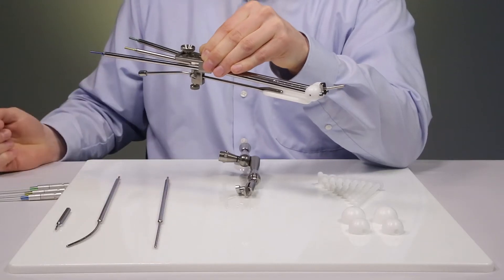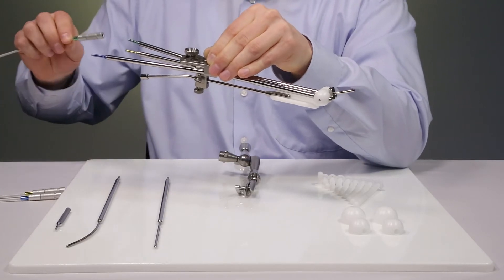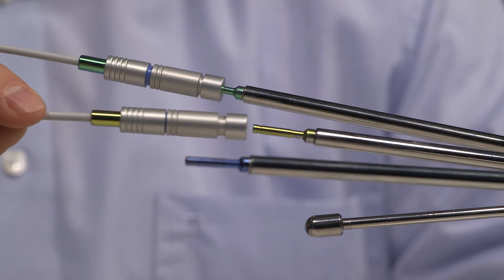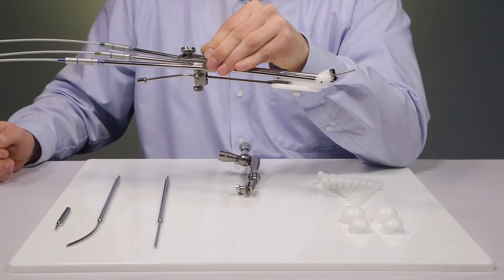In order to start the treatment, transfer tubes are needed. In case of Eckert & Siedler-Bebig afterloaders, color-coded transfer tubes are available. They are simply clicked on the tubes. Now the treatment can be started.